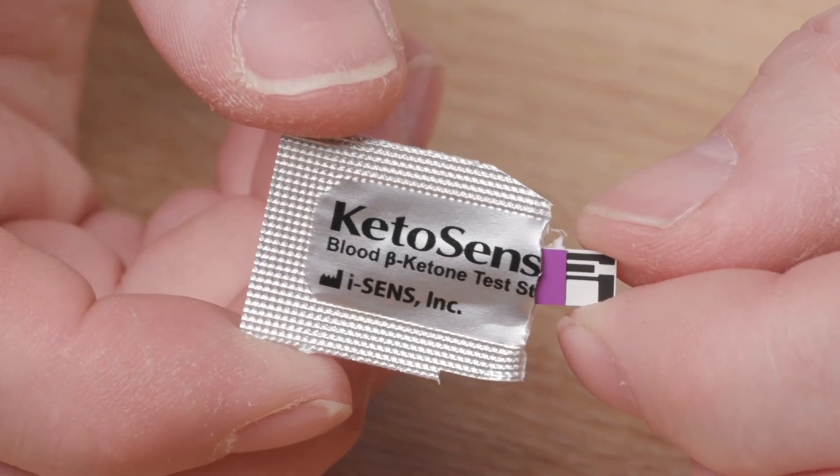Ketone testing should be carried out if blood glucose levels are above 14 mmol for over 4 hours. Your diabetes team will provide further education on this. To carry out a blood ketone test you are required to use the blood ketone strips, which look like this.